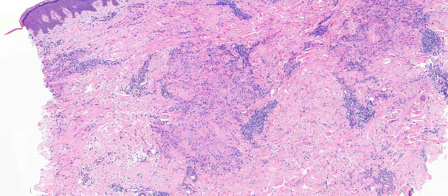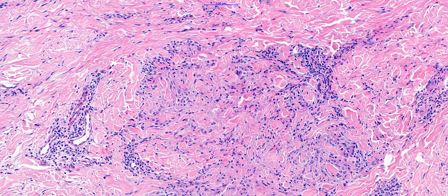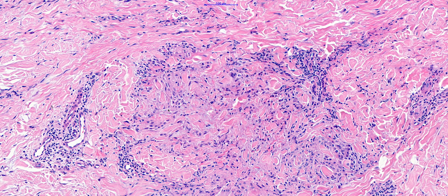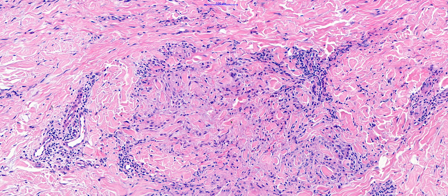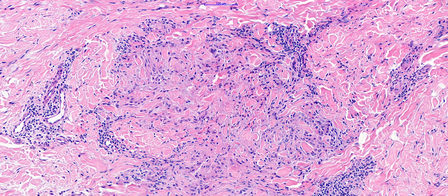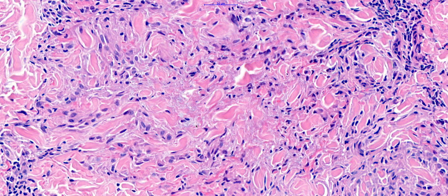Going a little bit closer, you can see these slightly pale coloured histiocytic cells, wrapping themselves around the dermal collagen and just starting to form a hint of a palisade around this area. The collagen in here is just starting to show degenerative features — it's slightly thicker and slightly more eosinophilic, and in some areas it's starting to degenerate and looks slightly stringy and mucoid.